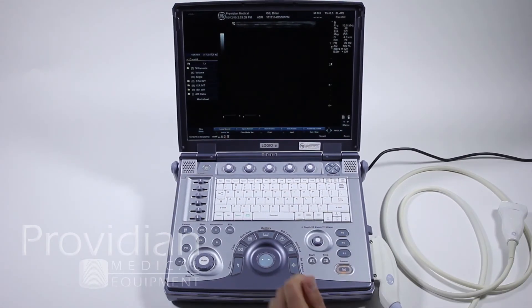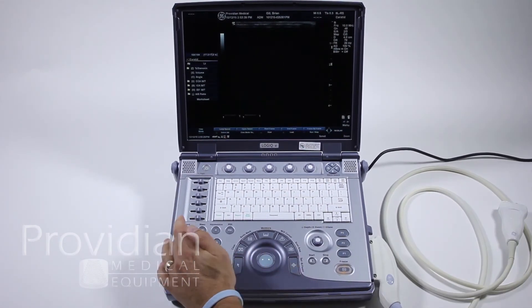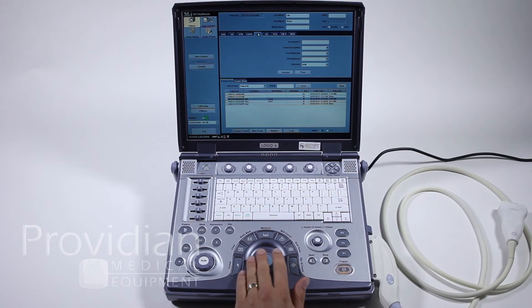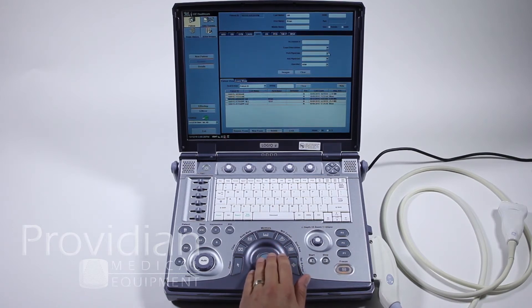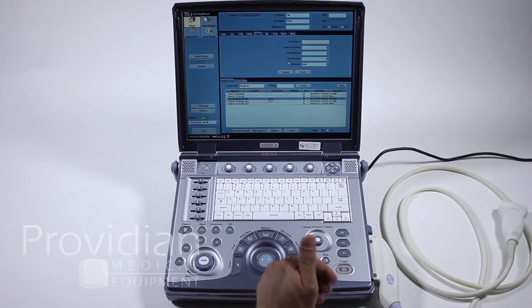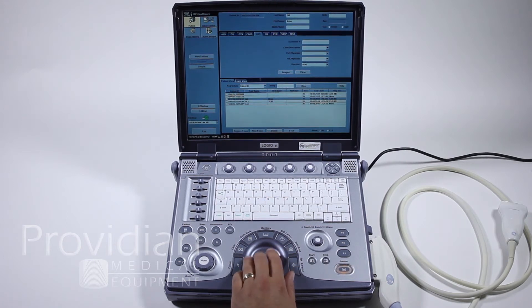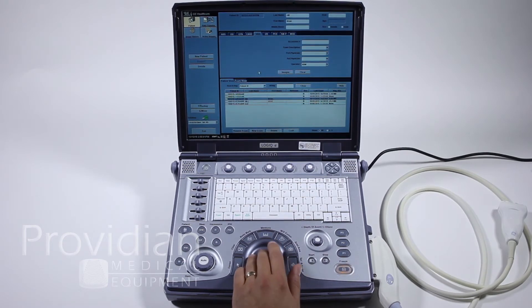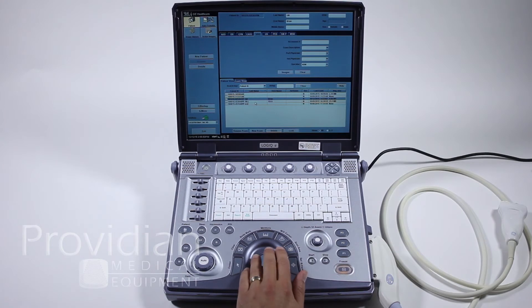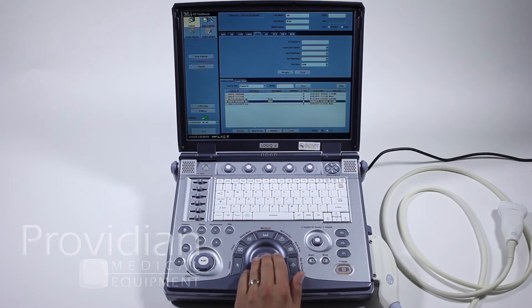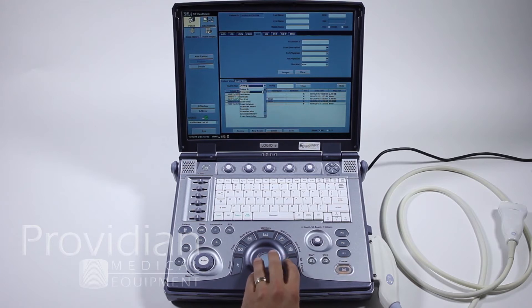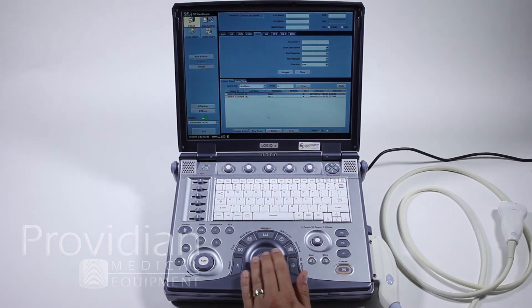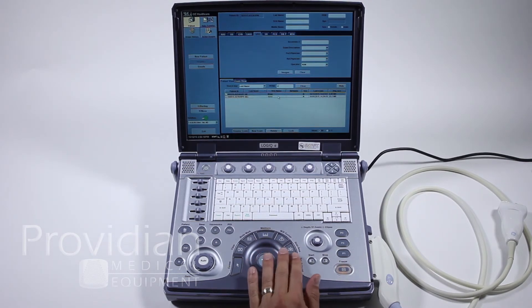So we've entered the patient ID. If we wanted to make changes to that patient information, we can click patient and edit it — add the type of exam, any numbers or physicians, or anything like that. If you have required fields, you can enter that information here. I can go back to resume exam or click exit. If I have a previous patient, I can click here to do a new exam under that patient — go down and search the patient list by last name, start typing, and it will show matching patients. Click on that patient and either click resume exam if done in the last 24 hours.